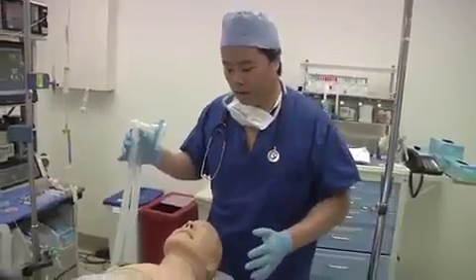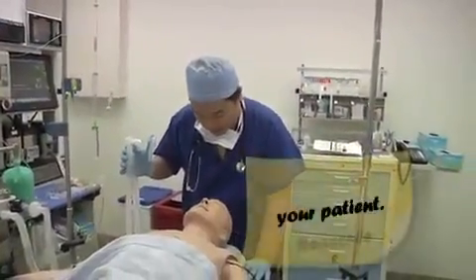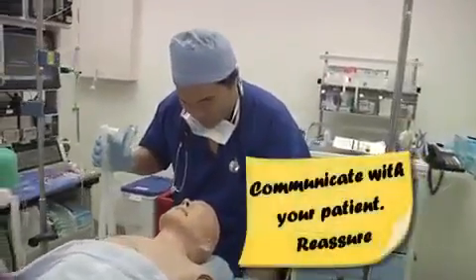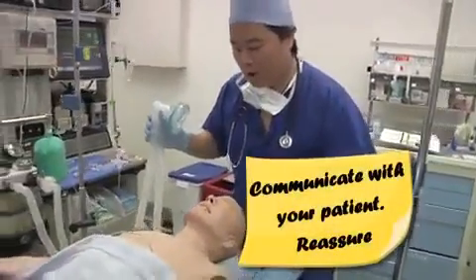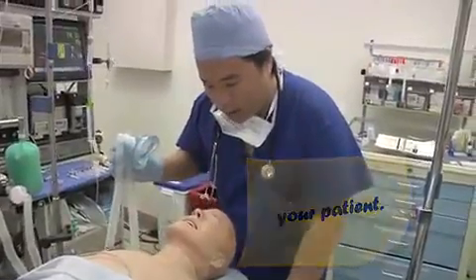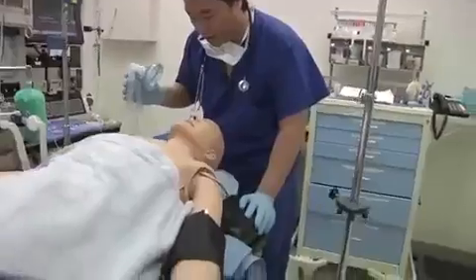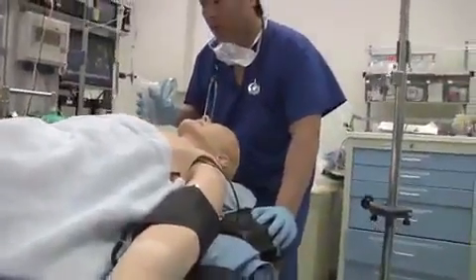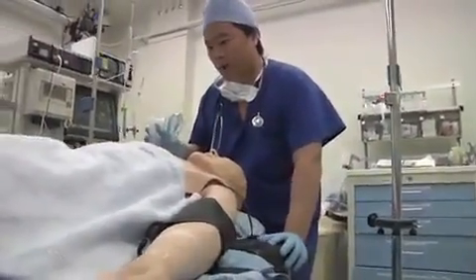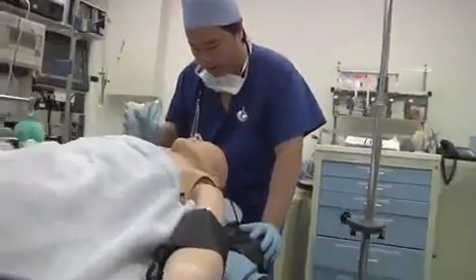So I'm going to just talk to Mr. Johnson here for a second. Mr. Johnson, how are you doing? Yeah, I'm doing okay. I'm a little nervous, but I guess that's normal. That is normal. I just want to talk to you a little bit and let you know what's going on. You might feel your blood pressure cuff squeeze your arm kind of tight. Are you feeling that? Yeah, it's a little tight. Now, the first time it squeezes your arm, it's going to be kind of tight, but then once it gets to know you, it won't be as tight, okay?